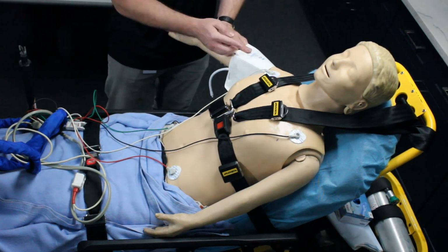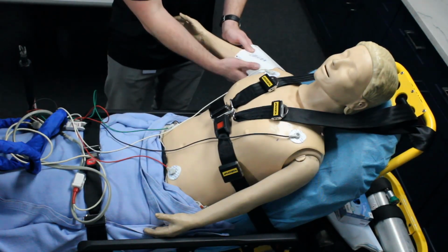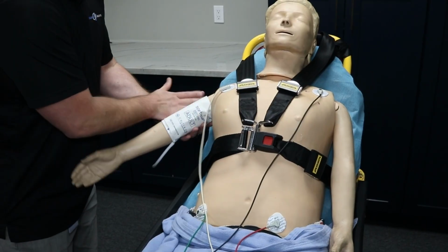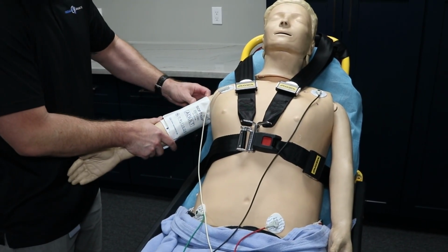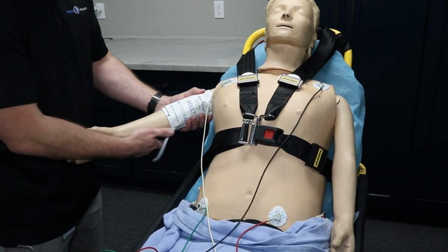Make sure this is in line with the inside or the medial aspect of the arm, basically in line with that artery, and make sure it is nice and secure, not super loose or flopping around. It shouldn't be sliding up and down, so nice and secure.